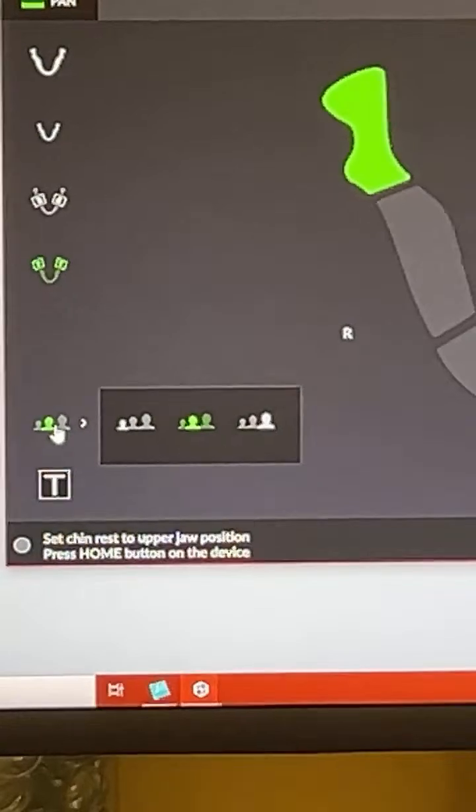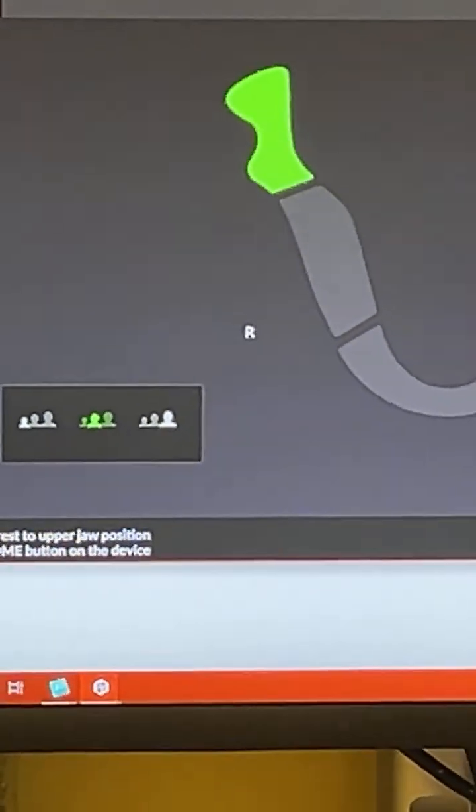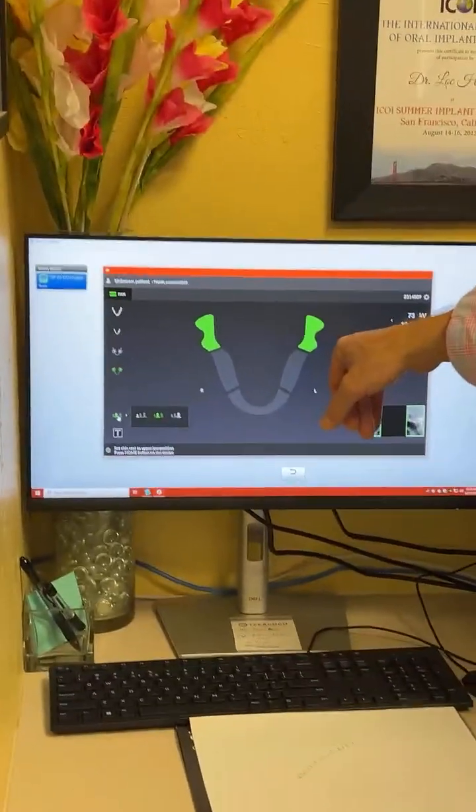So how many options for the bone density? This is it, for 3 presets. You can go in manually, but I don't recommend it unless you know what you're doing, because you're changing kV and mA. We're not gonna mess with that manually.